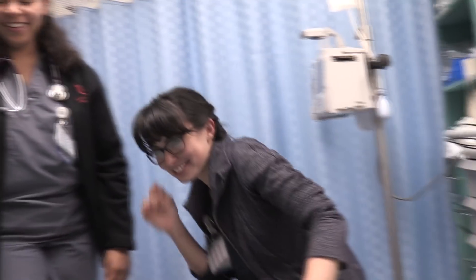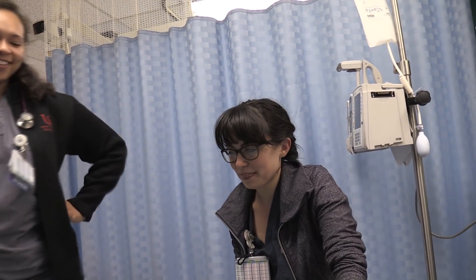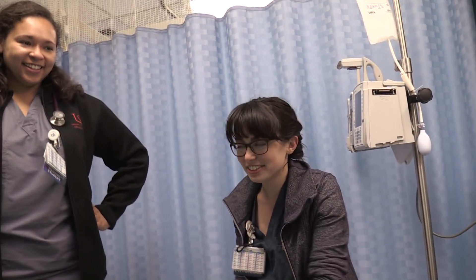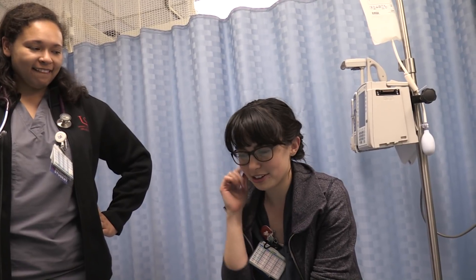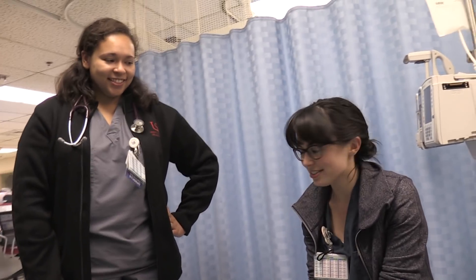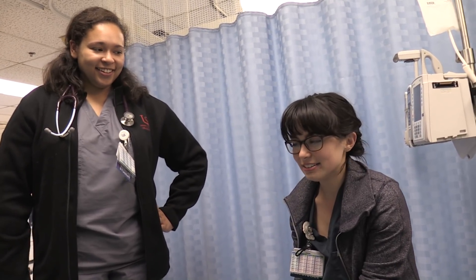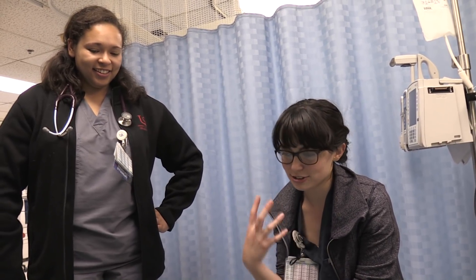Katie, besides the perforated eardrum, what was your experience with that? It's very noisy. So for a little kid, that might be difficult to accomplish because with the suction and the noise, it's definitely an odd, anxiety-provoking experience. Was there any pain in the process at all? It was not pain — there was a certain amount of discomfort just kind of related to the suction.